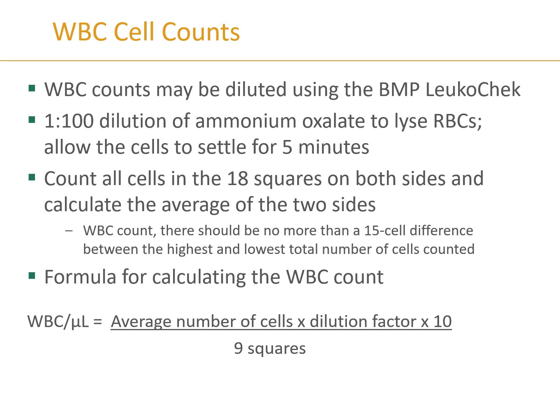And of course, once you've got those two counts, then you would, depending on what your criteria is for your site, you may report an average of those two, or you may do the total and do that division by 18 squares instead of 9. But your site will have specific formulas for these particular tests as far as what they want you to use in the reporting, and so that is what you will follow for your site.